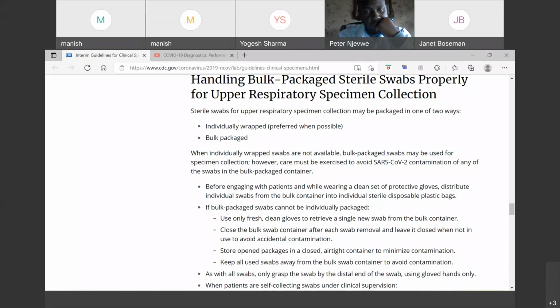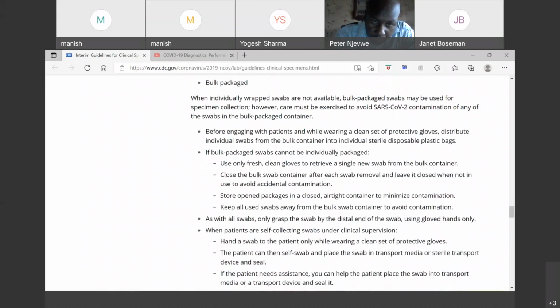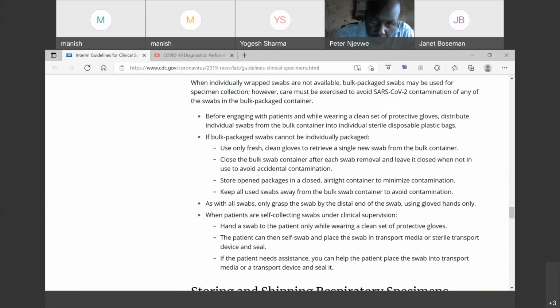Before engaging with the patient and while wearing a clean set of protective gloves, distribute individual swabs from the bulk container into individual sterile disposable plastic bags. If bulk packed swabs cannot be individually packed, use only fresh, clean gloves to retrieve a single new swab from the bulk container. Close the bulk swab container after each swab removal and leave it closed when not in use to avoid accidental contamination.